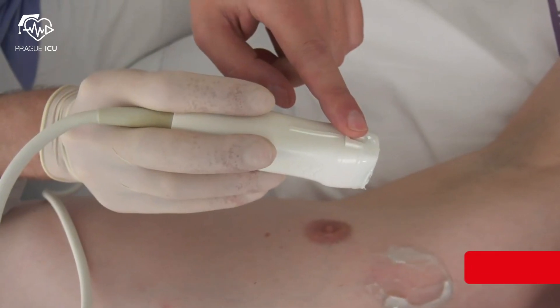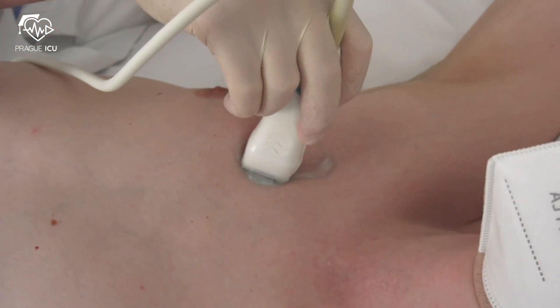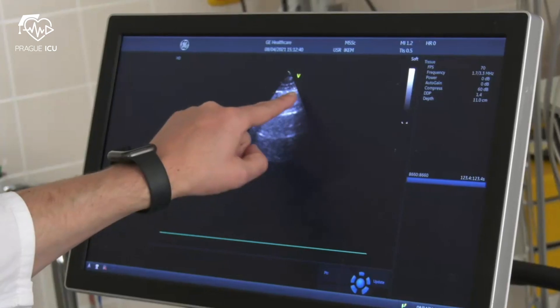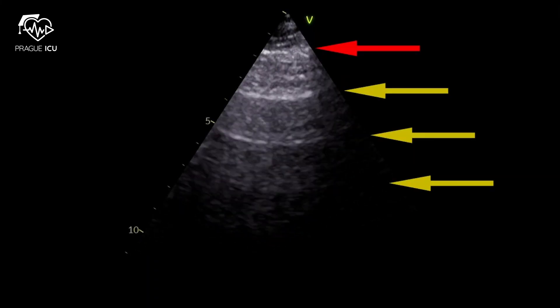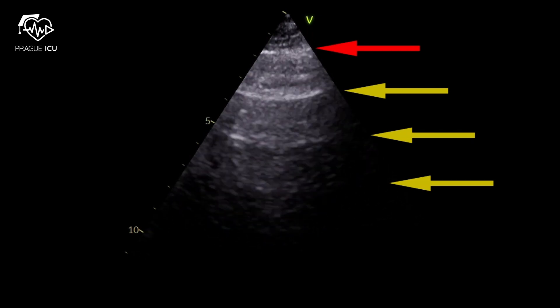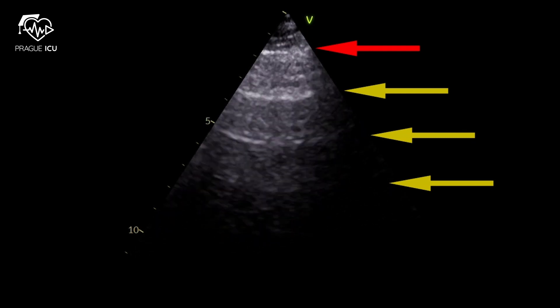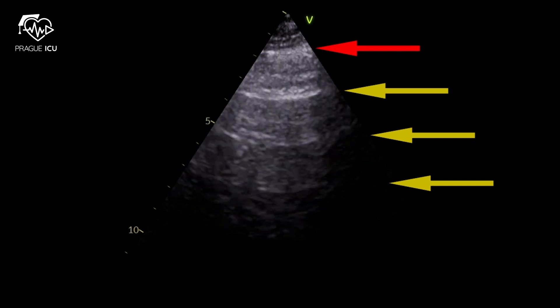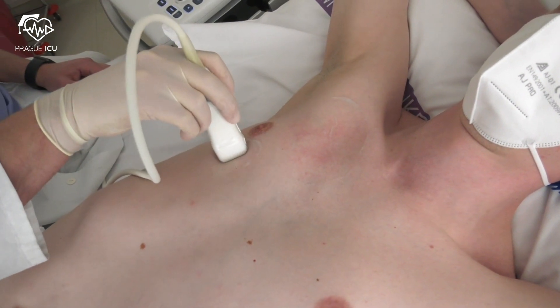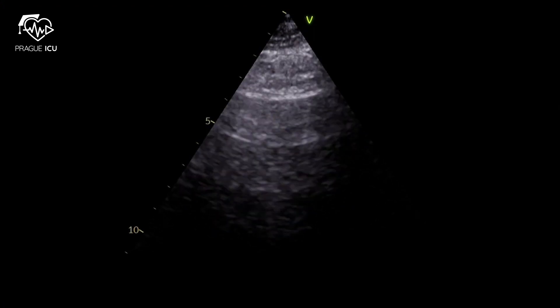When scanning anteriorly, the probe should be placed in a longitudinal orientation with the probe marker dot towards the patient's head. In B-mode we can see lung sliding, which represents sliding of the visceral over the parietal pleura. Lung sliding rules out pneumothorax. Yellow arrows correspond to A-lines, which are horizontal reverberation artifact lines originating from the visceral pleura, indicating normal aerated lungs. We then continue with the inferior part of the anterior zone, placing the transducer in the longitudinal axis where lung sliding is most clearly demonstrated.